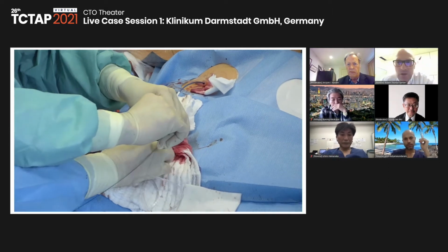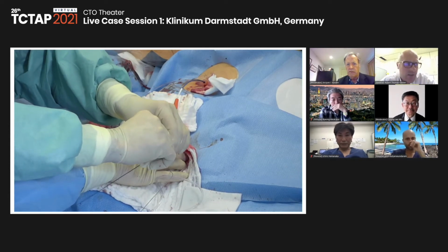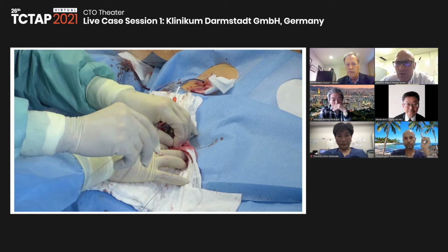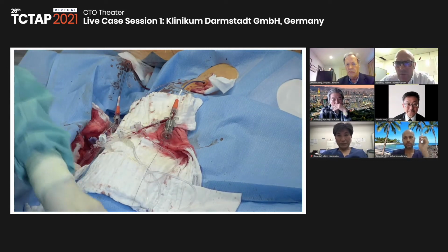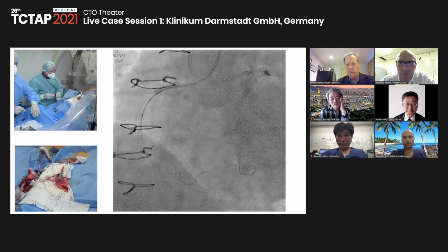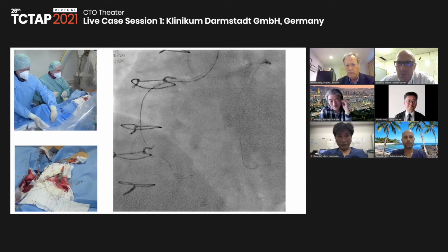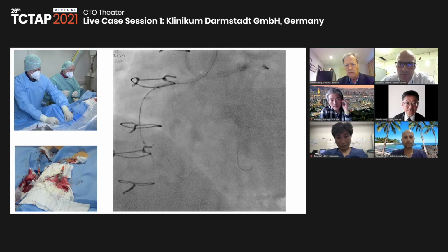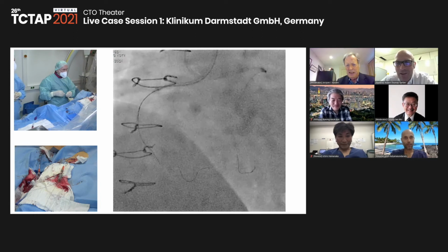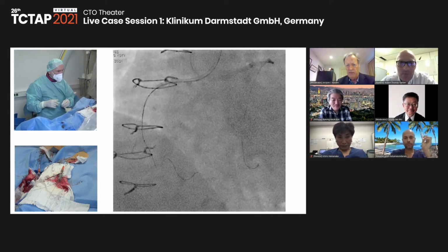So it's very important. A comment. I don't use Fine Cross very much, particularly in calcified vessels. I'd probably go with the Turnpike or something a bit more tapered, just because I'd be worried that if you got the wire through the occlusion, the microcatheter may not follow. But yeah, you will be surprised. The Fine Cross almost always follows. Because you cannot work with a Turnpike in the 7 French IVUS setup. You need to have 8 French then.